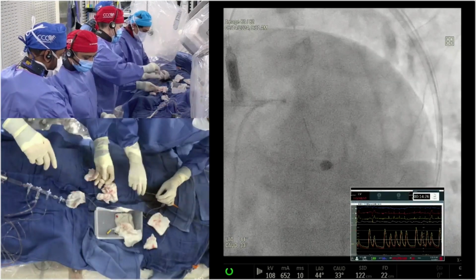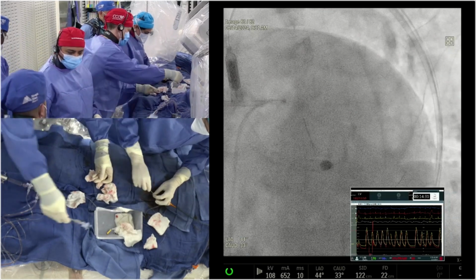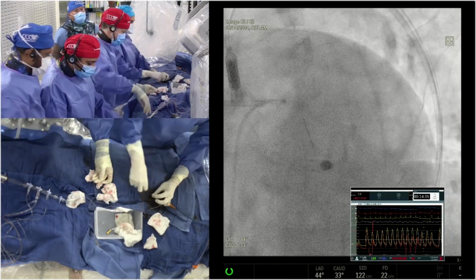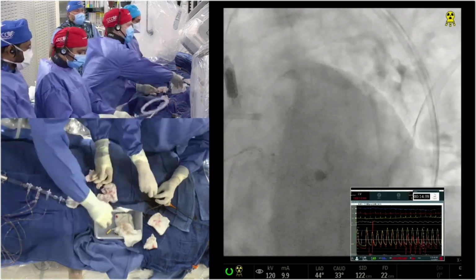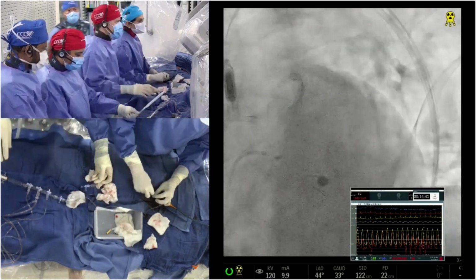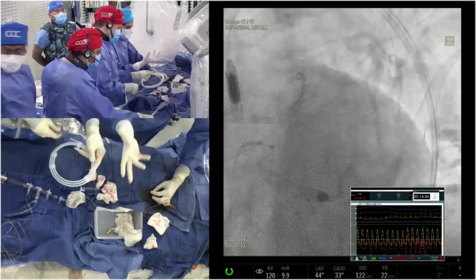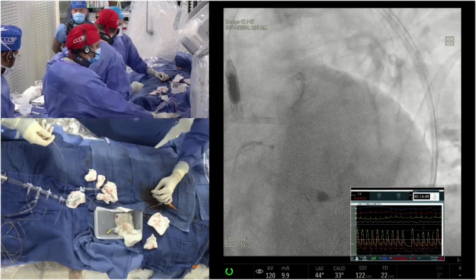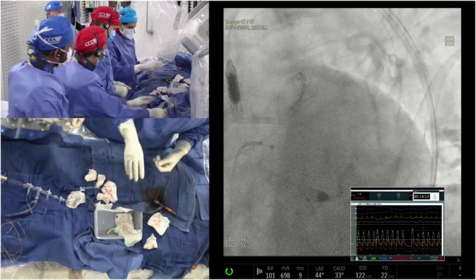As you're doing that, I think what's amazing here is that in hemodialysis patients we have very, very little data. These patients have so many things going on with them and so little data on what to do and how to approach them. I always think this is an area where we should have more focus on understanding, because the number of these patients is going up. Dr. Bhatt, what do you think should be the approach?